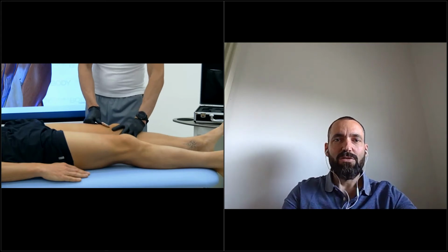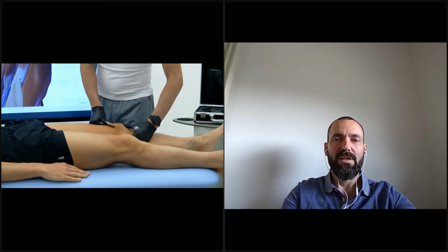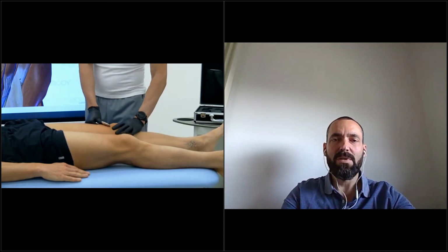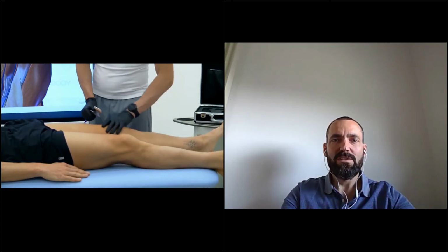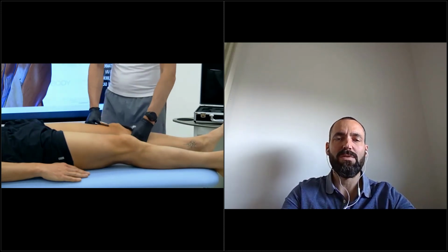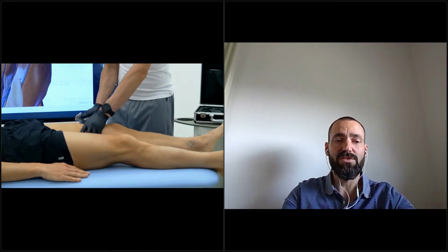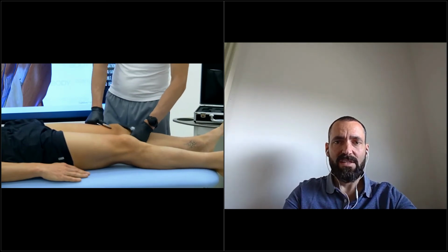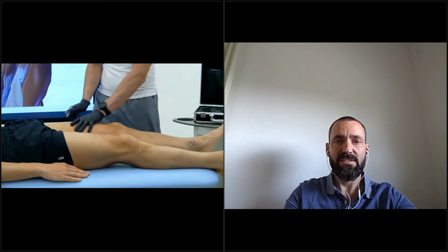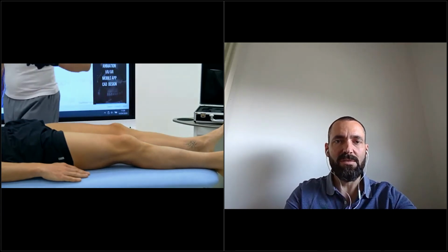But I didn't know what else I could do for him, so I decided to focus my treatment on the adductor. And after two or three days, he was much better. So in this case, the cause of his pain was not the place where he felt the pain, but the adductors. I used manual treatment, fascia tools, the Dia Blade as you are doing now, and I focused on the densification in the trigger points with the Dia Trigger. It was a really painful treatment, but the result was unbelievable in just a few treatments, after a long time without good results.